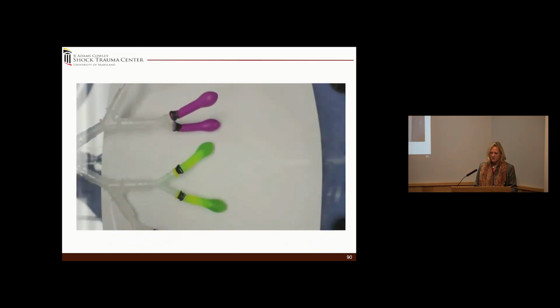So we had some respiratory therapists who were challenged with a project that they had to do, and they actually took this study and redid it. They created a bronchial tree with little balloons, and they filled each balloon with guar gum. Okay, so they created this mucus. And then what you're going to see is a time-lapse video. We sped it up, but for the exact same amount of time, comparing pressure control with APRV. Pressure control 1-to-1 with TCAV, okay?